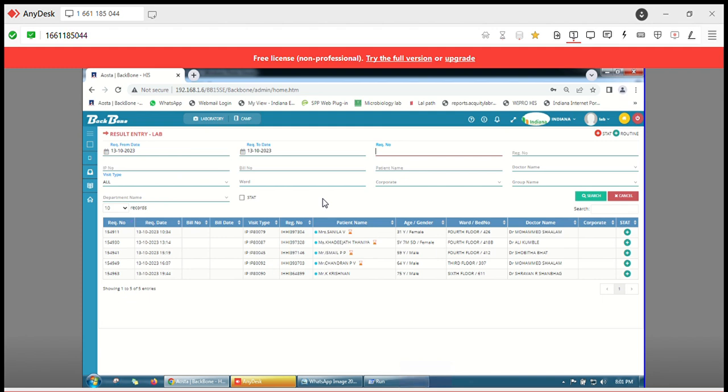Make it a point that if in an emergency the sample is coming where the patient is not yet registered, the staff has to bring the book where they have written the patient name and the test they want done. On the vacutainer, if the UHID is not created, at least the proper patient name should be written. You identify both, take our own manual barcode, and stick it on those vacutainers. You stick it on the book also, to record at what date and what time the sample was received, and then you sign the book to confirm that you have received such a sample.